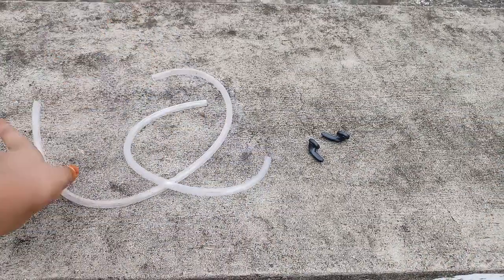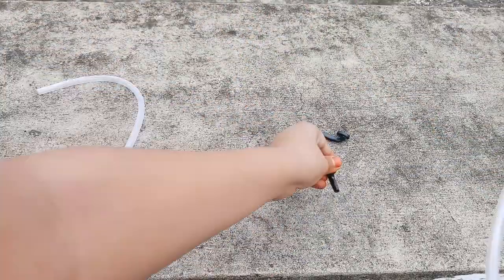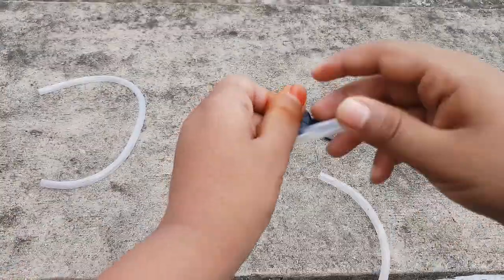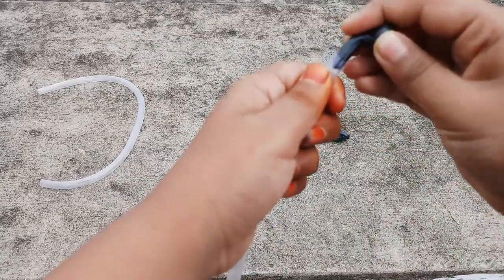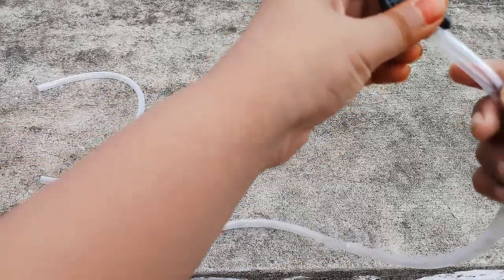Now, in the bigger pipe, you have to insert the earphones. I am going to insert the earphones in the bigger one like this. You just insert them like this, and in the other hole, you insert like this.